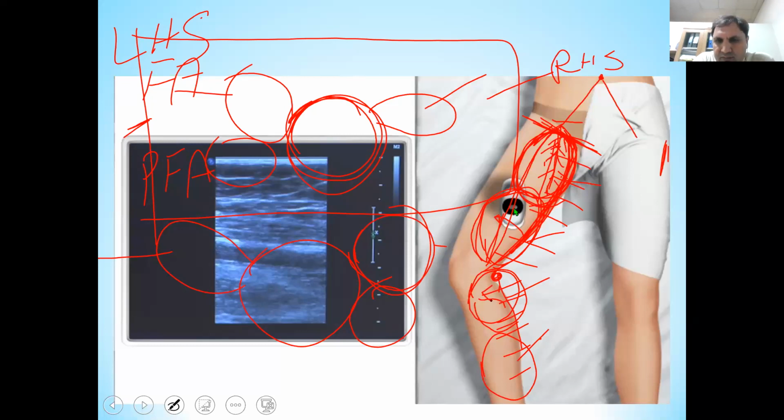But unlike the deep venous system, the superficial venous system is not tightly bounded in muscles, and they are covered by superficial fascia and the subcutaneous fats and the skin, and they can very easily dilate abnormally, which is called varicosity.